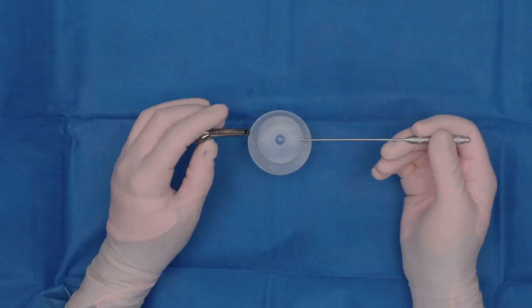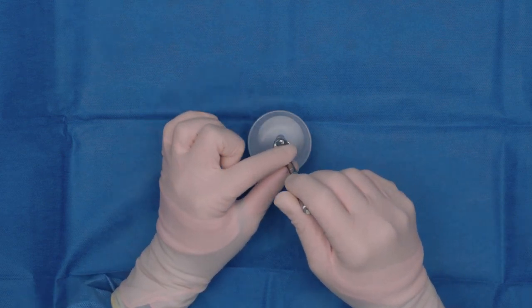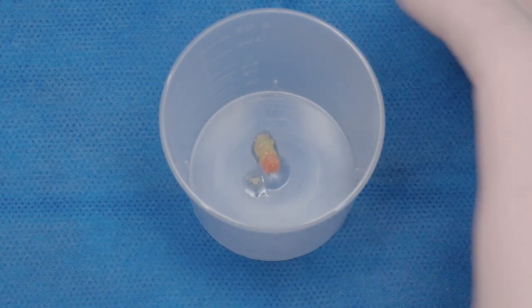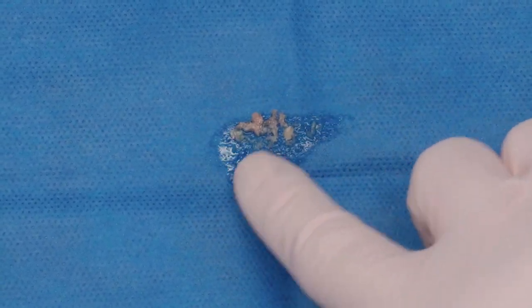Then we take the plunger to expel the graft. You can easily place it in the tip and do it right over a sterile container to expel the graft from the shaft of the OsteoAuger. If we look at this graft, you can see that it's all a very equal consistency. And if you need more, you're able to take multiple passes as discussed earlier.